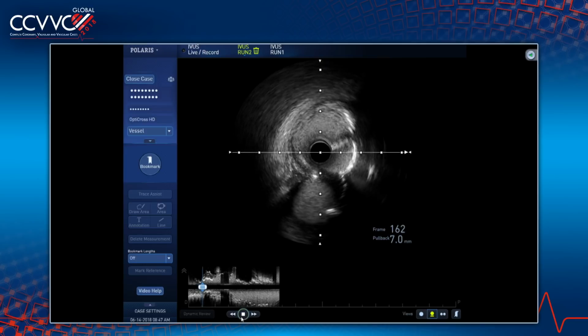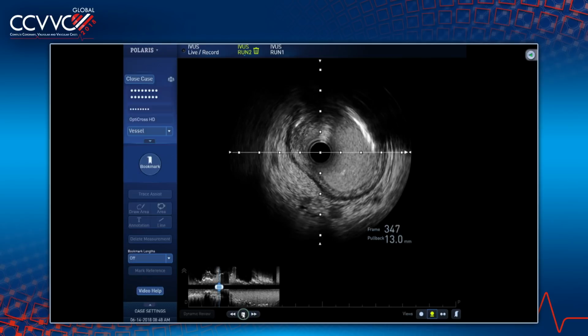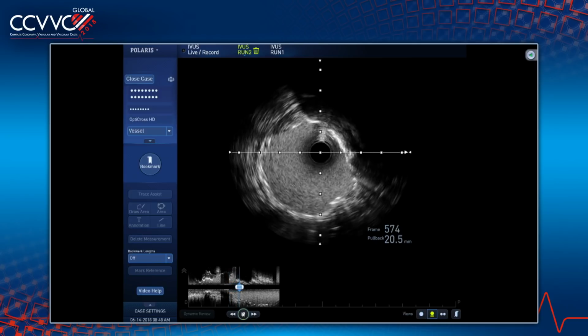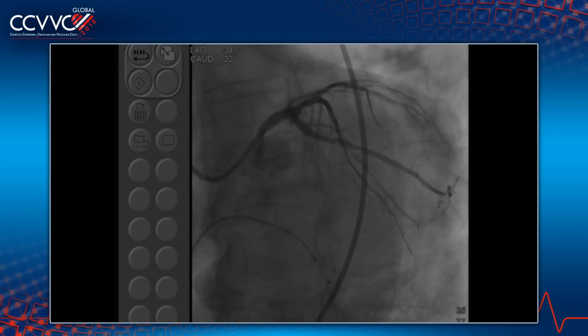So it looks like the distal edge looked good. I didn't really see it. I'm sorry, I was kind of distracted talking to the panel. Does the distal edge look good on there? If not, we want to go back to that first case in the OCT and try to see what happened in that first case. Okay, that looks good. All right, we are done.